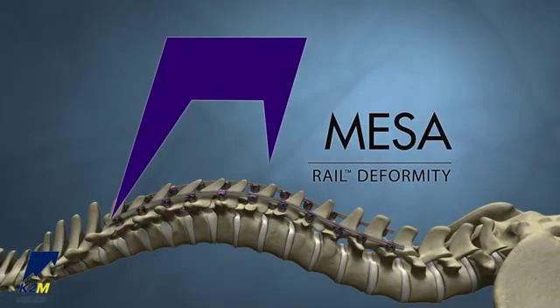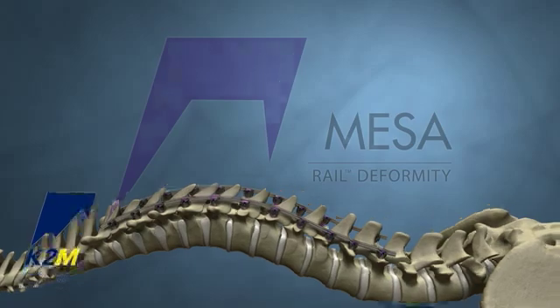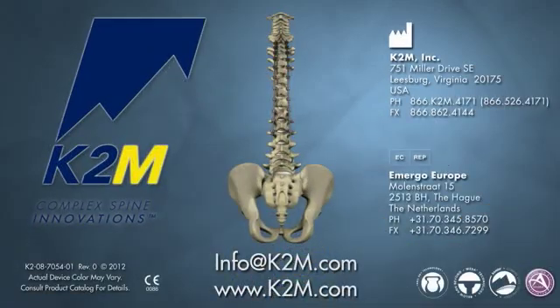The MESA Rail Deformity System. From K2M, Complex Spine Innovations.